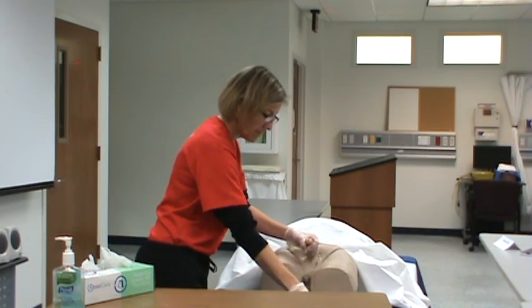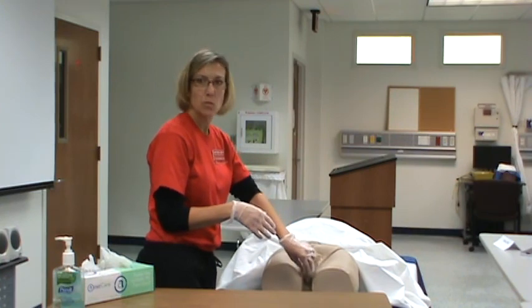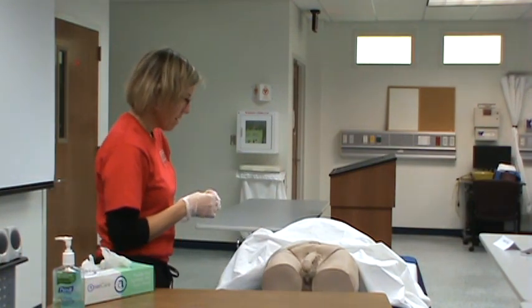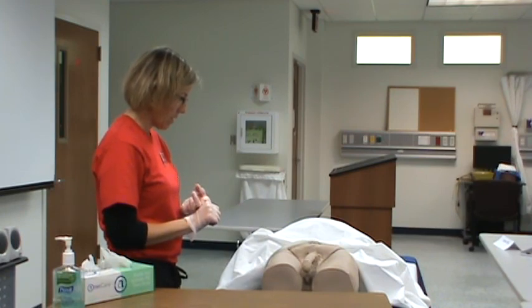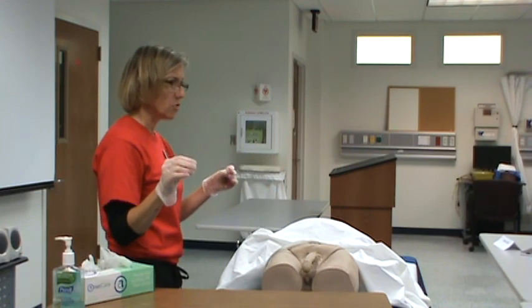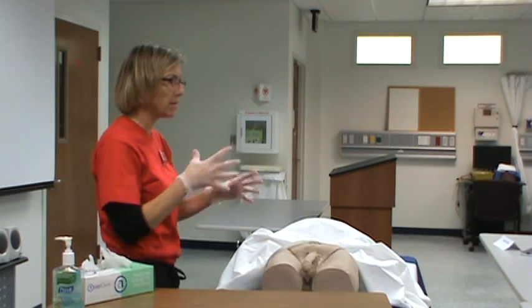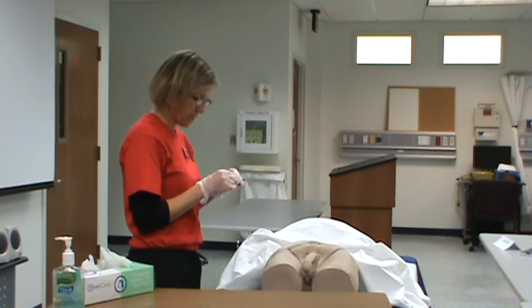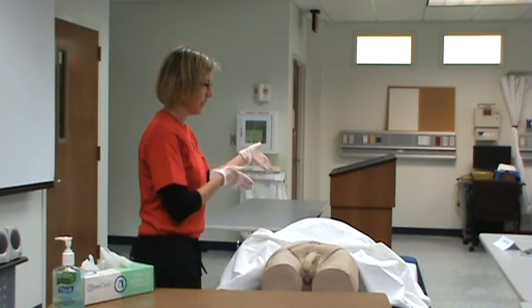Again, if the gentleman has an uncircumcised penis, you're going to retract, is that the word? Replace the foreskin back where it was before. So those are the retraction of the foreskin, the cleansing of the meatus, the drape you can choose to use with the male. I think the fenestrated drape with the diamond makes more sense with the man, a little easier to maneuver, and then it gives you a target area. That makes sense. Trying to think if there's any other differences with the man. Am I hitting it all? Okay, any questions about either of these.